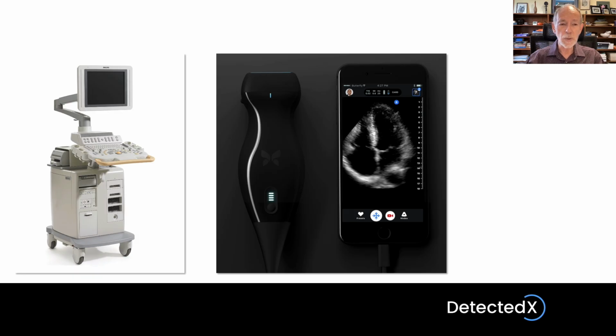Obviously, there's going to be an enormous difference between these two machines. And yet, the important thing is that the fundamentals of how ultrasound images are made are the same between these two. And that's what I'm going to be describing in this talk: the basics of the processing of the ultrasound image, which are pretty much the same in all machines.